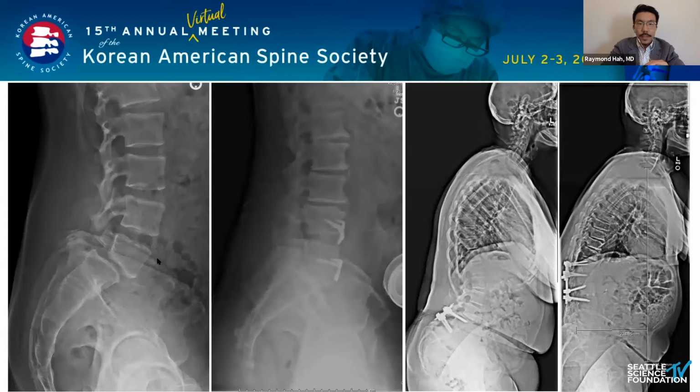It looks like in the second patient, the previous spine surgeon did try to do that and had paid some attention. But if you look, the pelvic incidence is probably in the low to mid range on this patient, and they're still collapsing and spondylolisthesing above and really losing their lumbar lordosis. So the revision strategy here, which I'll circle back to, even though this patient may not be at risk for mismatch based on their anatomy, may now need to be treated differently.